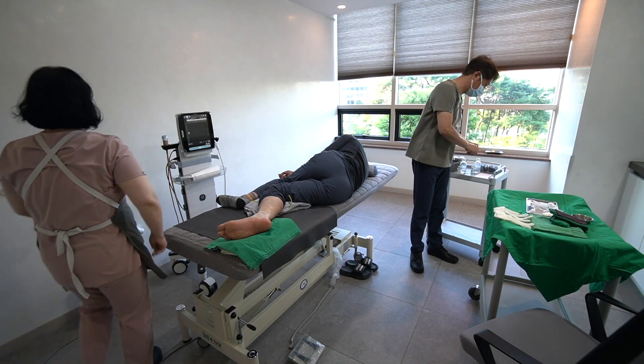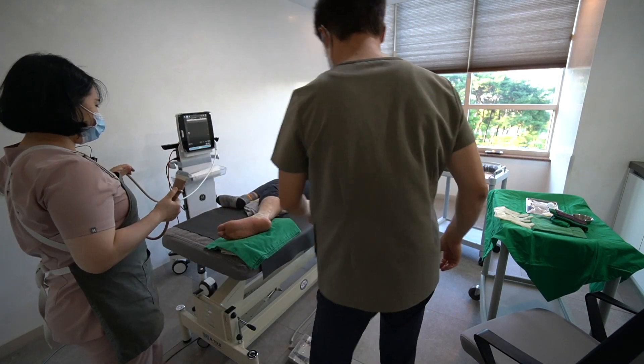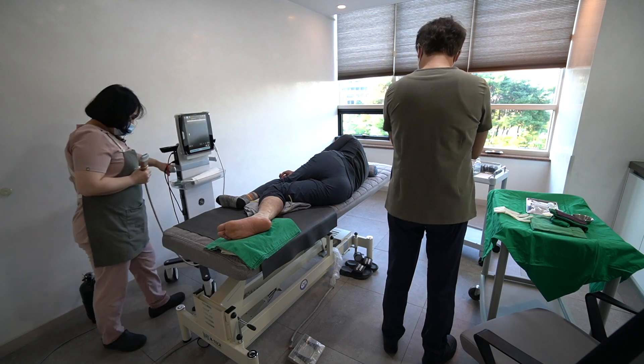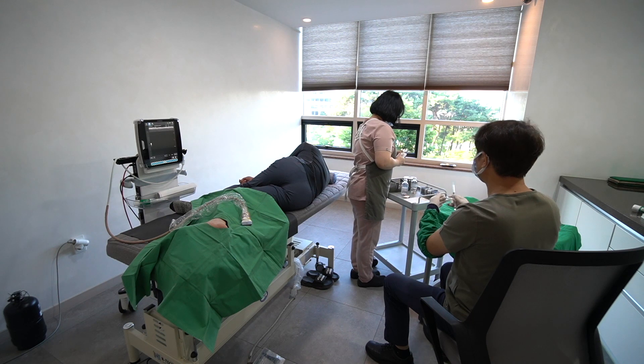I let the patient take a lateral decubitus position facing the wall and cross the leg, placing the medial ankle of the operative side upward. I will block the tibial nerve before other procedures.